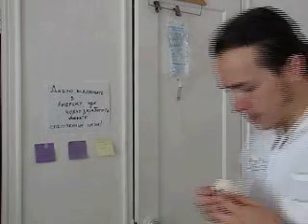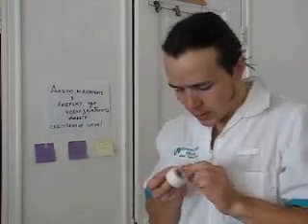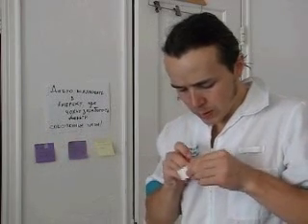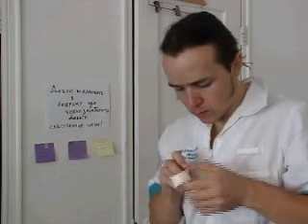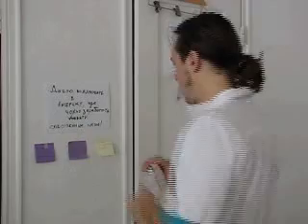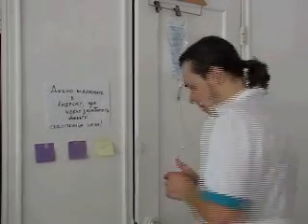So, we want to prepare our equipment. We're going to prepare a little label where we're going to write the date, initials, and the time of the secondary line placement. We're going to put it here.